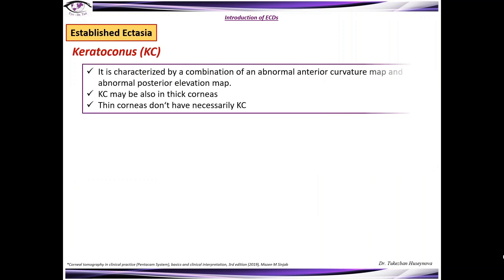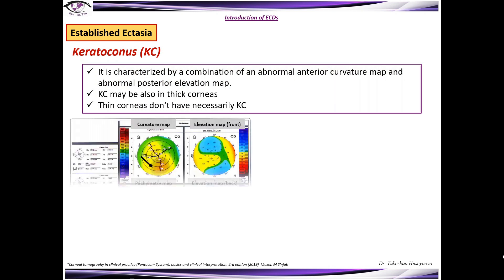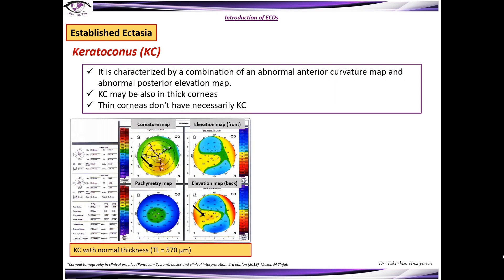Keratoconus is characterized by a combination of an abnormal anterior curvature map and an abnormal posterior elevation map. Importantly, keratoconus might also occur in thick corneas. As you can see here, the patient has an abnormal curvature map and abnormal posterior elevation map; however, the thickness is 570 microns, which is higher than average.